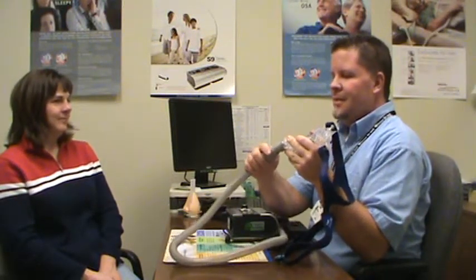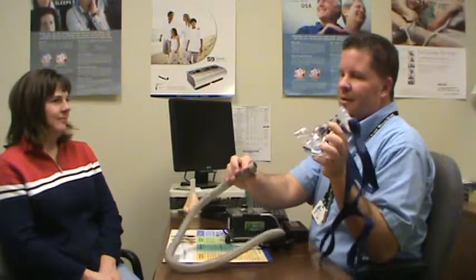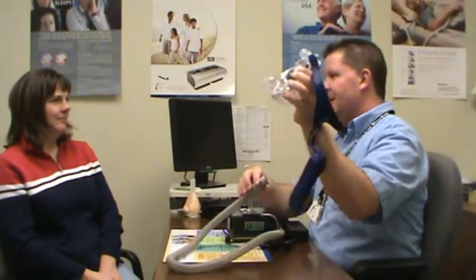The first is your spout. It's where your hose is going to hook onto. Your hose has a rubber tip. It slides on to that connection just like so. This also acts as a quick release on the mask. It allows you to just give a tug on the hose, releasing the mask from the hose. You can go about your business, come back, and just snap that back on.